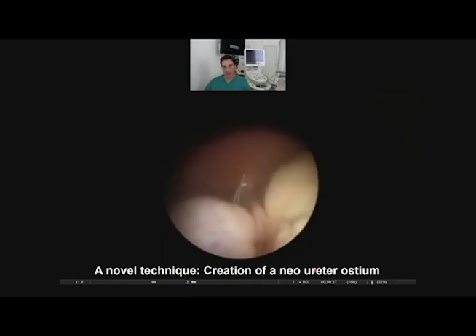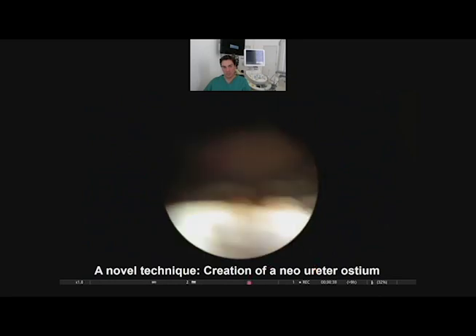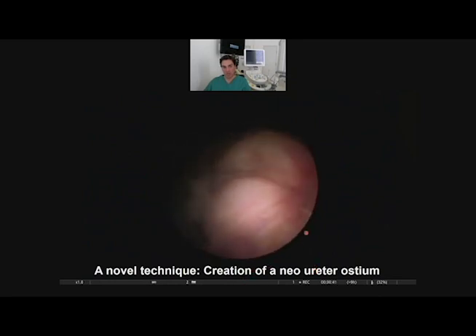What we do now is another technique to create a neo-ostium. In ultrasound, we check before where the ostium is, and we have no chance to find the way to the end. If you cut it, a bladder vaginal fistula will develop, because that case was treated 3 days before. The ureter in the distal part is destroyed. This is the left ostium. This is the other side. And what we do now is we want to find the way to the ureter, near side by side of the bladder. It is a simple trick.